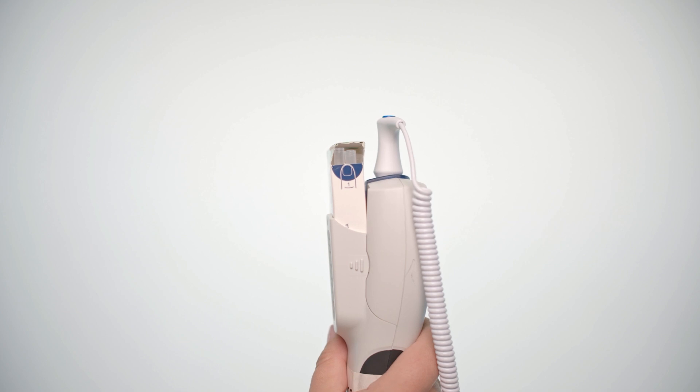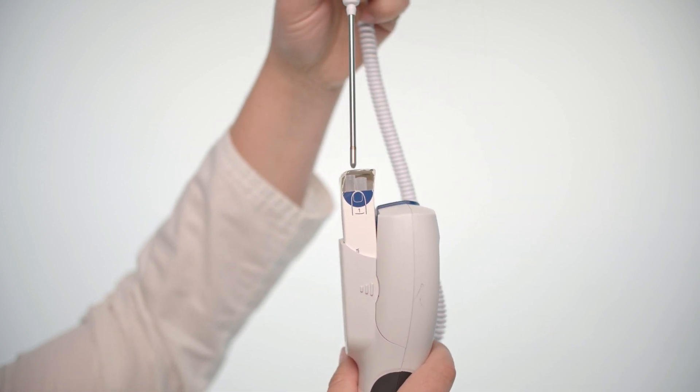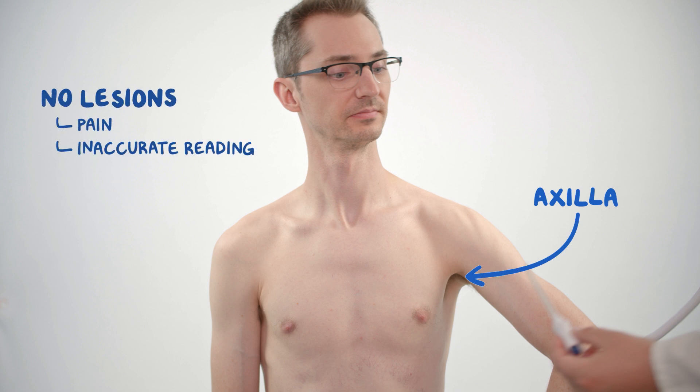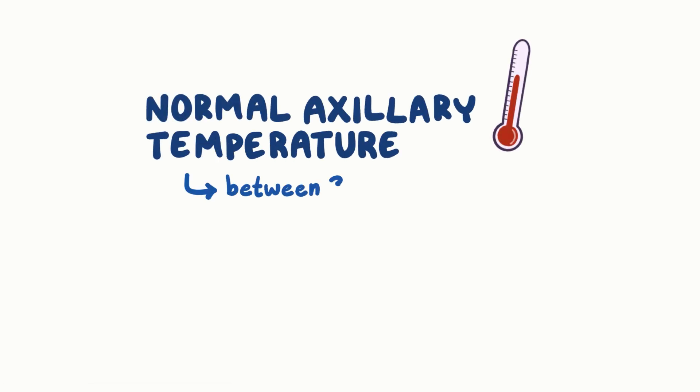We can also take Fred's axillary temperature. Attach the blue oral probe stem to the thermometer. Slide over a disposable probe stem cover. Lift up Fred's arm to reveal the axilla. There should be no lesions present. They may cause pain or an inaccurate reading. Center the probe in the axilla and fold Fred's arm over and onto his chest. Again, wait until you hear the thermometer chime. A normal axillary temperature is between 35.5 degrees Celsius and 37 degrees Celsius or 95.9 degrees Fahrenheit and 98.6 degrees Fahrenheit.